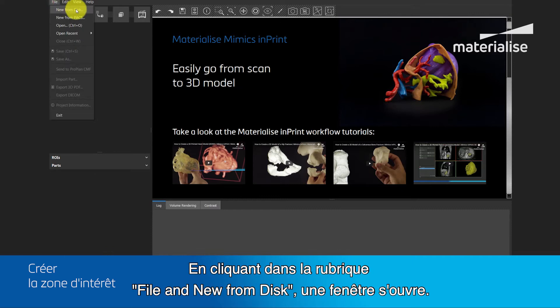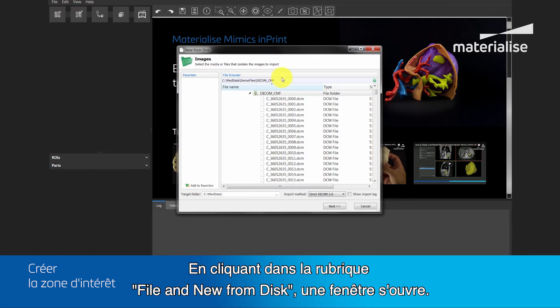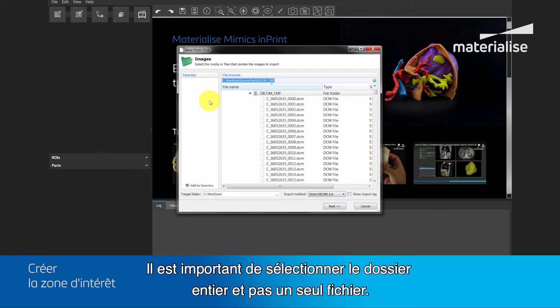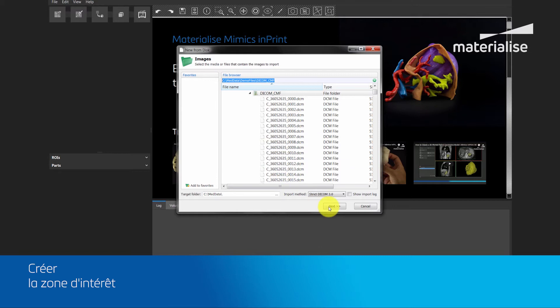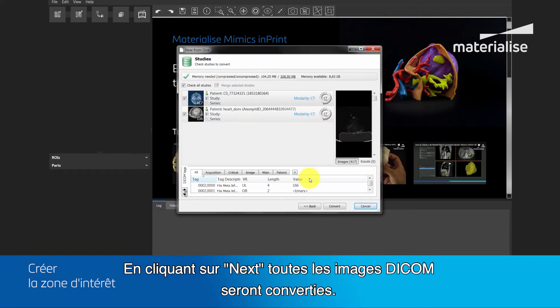By clicking File and New from Disk, a folder selection window opens. Here you can select the location of the DICOMs. It is important to select the whole folder, not just only one file. By clicking Next, all the DICOM studies will be converted.